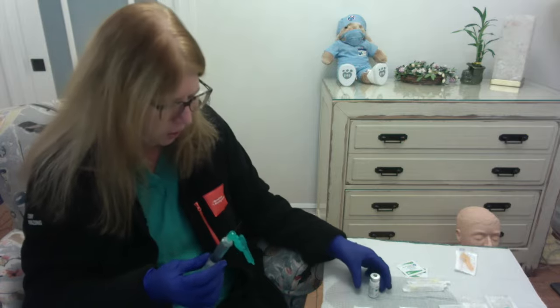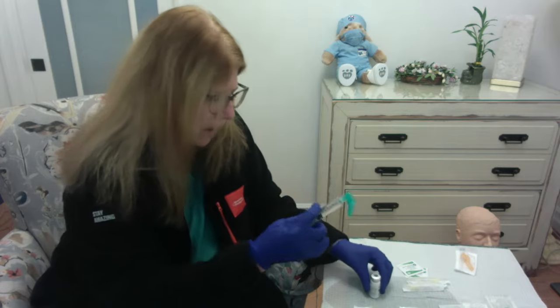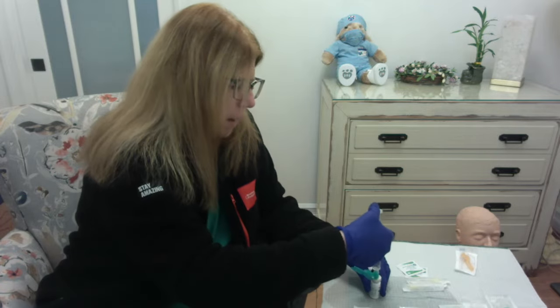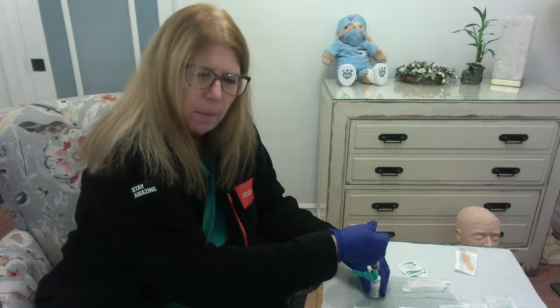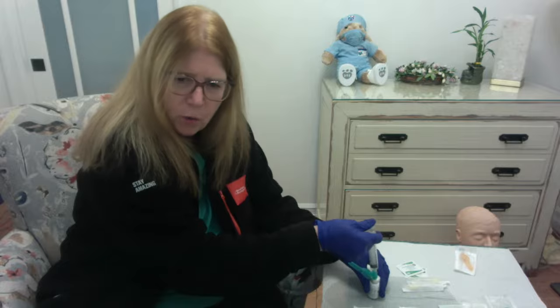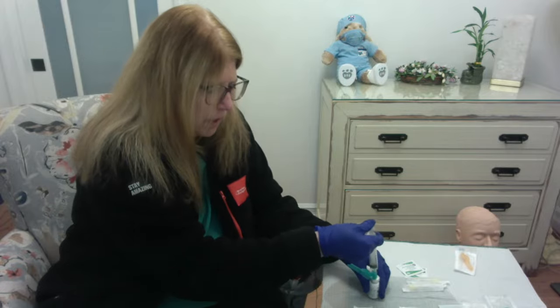I am now going to put this diluent into my powder vial, right? So right in the middle, bullseye, I'm going to push this liquid in, and then I'm going to remove the needle. But before I remove the needle, there's a lot of pressure. I'm holding this really tight with my right thumb. I'm going to let this plunger come back.